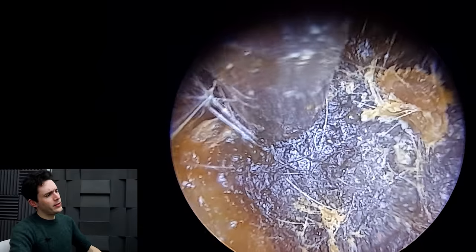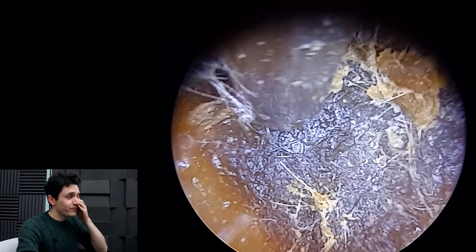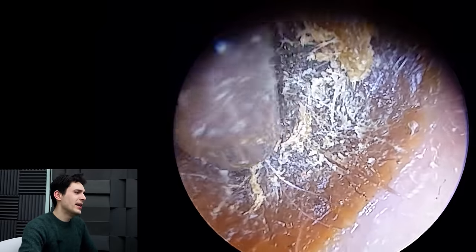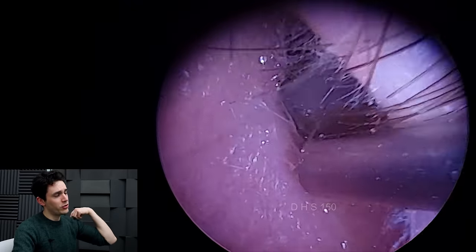And this patient, as you can see, it's just a brick wall really. We're not going to get through this wax. It's the kind of classic wax hair mesh, I suppose you could say. And what we're going to do actually, we're going to take a slightly different approach here.